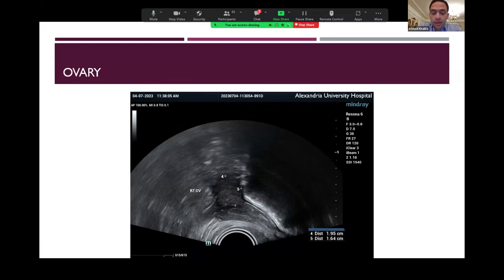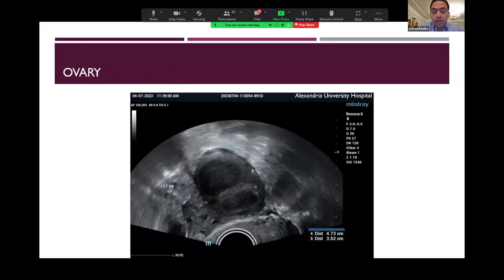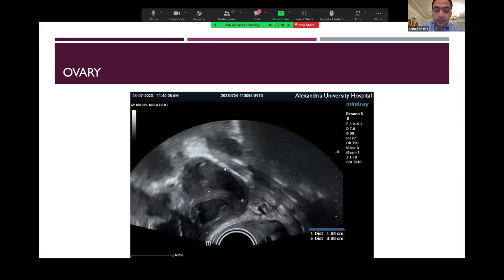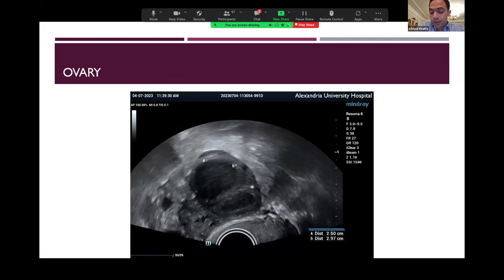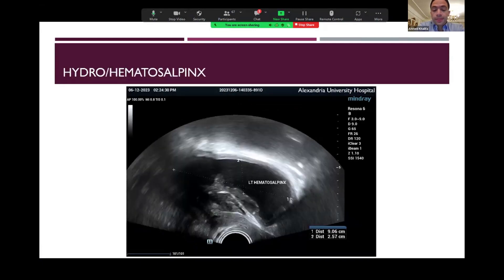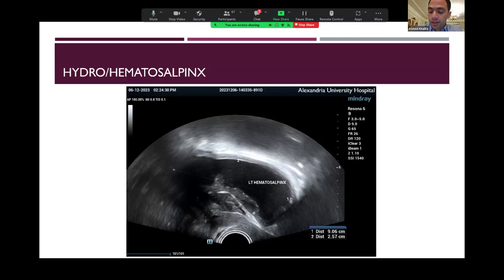After scanning the uterus and checking for any pathologies or lesions like adenomyosis and fibroids, we will shift to the ovaries. We will take the dimensions of the ovaries in three dimensions. If there is any particular lesion in the ovary like endometriomas or any other types of ovarian cysts, they will be measured individually and included in the ultrasound report as an independent item. After assessing the ovary, it's very important to check for hydrosalpinx or hematosalpinx, which can be a sign of pelvic adhesions and chronic pelvic inflammation, and is an important indicator to search for any lesions of deep endometriosis.